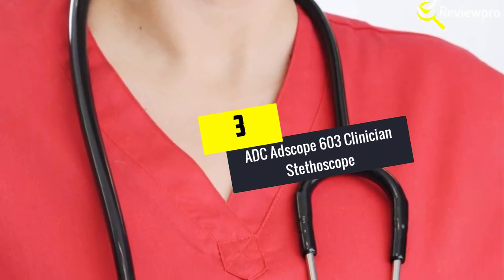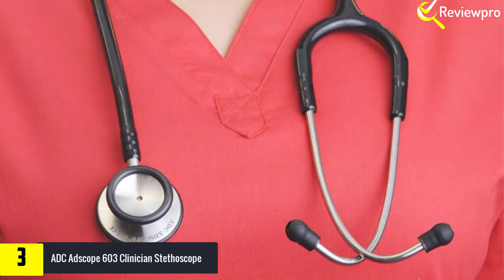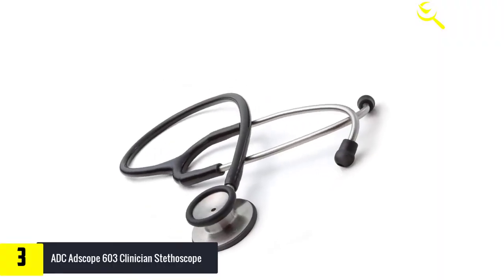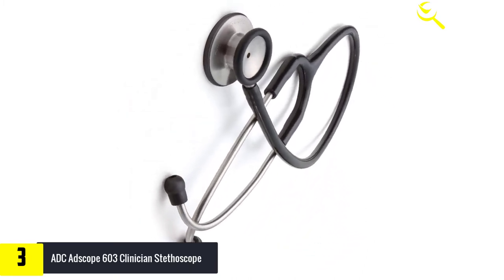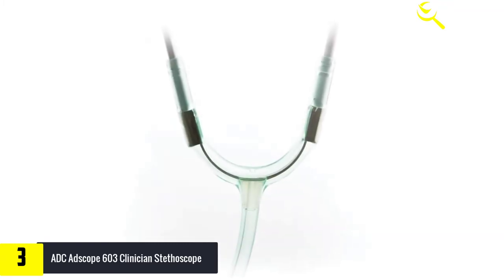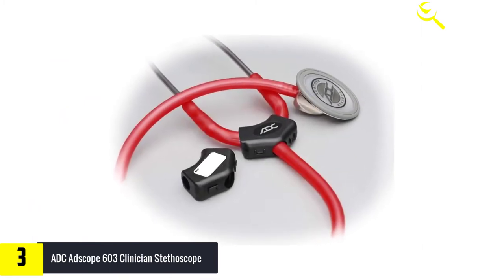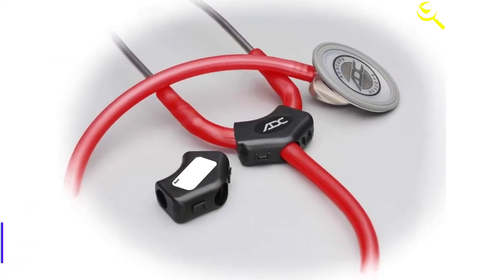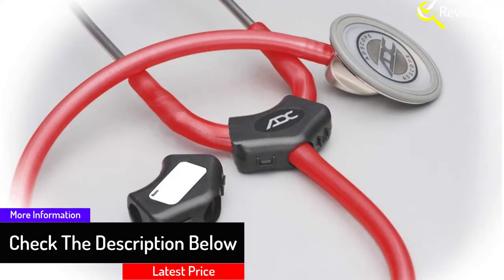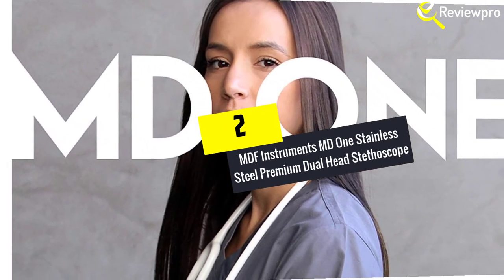At number three, we have the ADC Adscope 603 clinician stethoscope. This clinician stethoscope comes with AFD tunable technology that makes it more rugged and high-performance than others. The bell and diaphragm are machined to precise tolerances for optimum durability. You will also be impressed with the highly sensitive diaphragm that makes amplification excellent, along with crisp and accurate high-frequency transmission. This item comes with two extra pairs of ear tips and a storage case along with an ID tag. However, some users find the ear tips uncomfortable, and the color may appear different than expected.